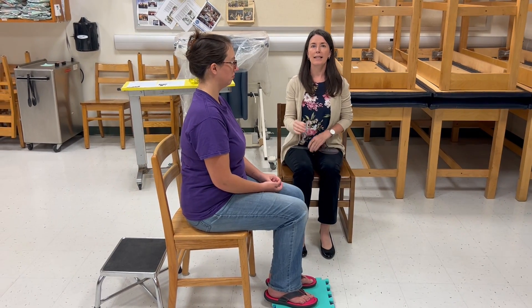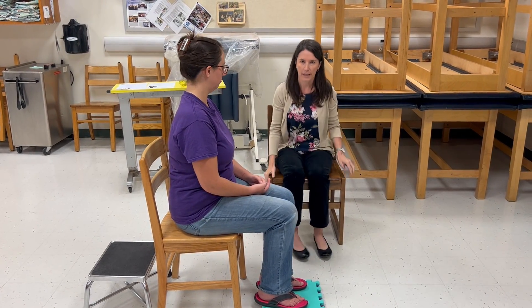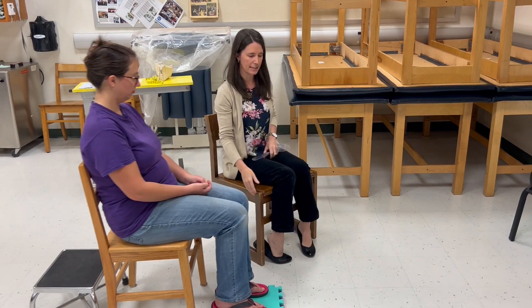If someone is limited in trunk rotation, I want to demonstrate a compensation that will happen. You might see either excessive cervical rotation or scapular protraction and retraction. If rotating to the right, the right scapula might retract and the left one might protract. If we see that extra shoulder motion — that's not trunk motion — we need to make sure we eliminate it because it's going to throw off our measurement.